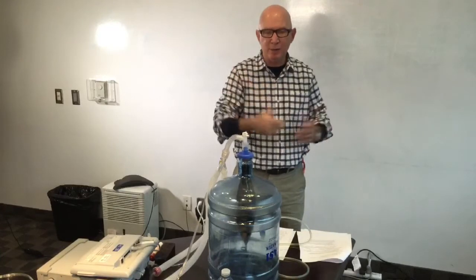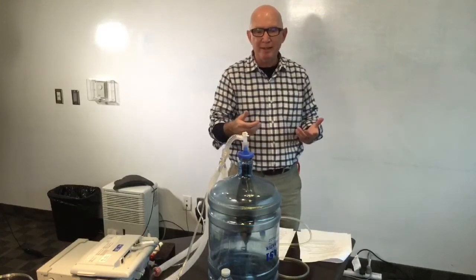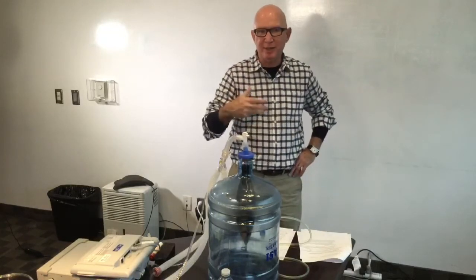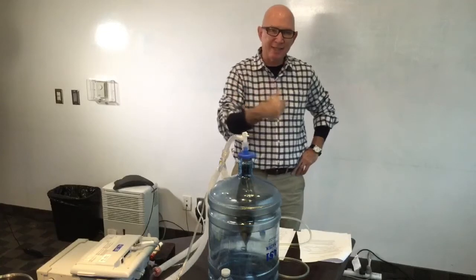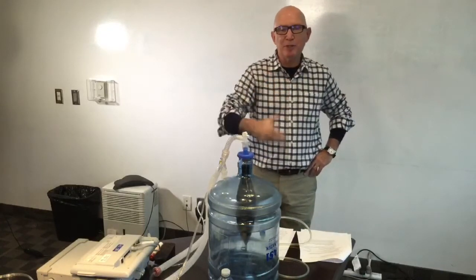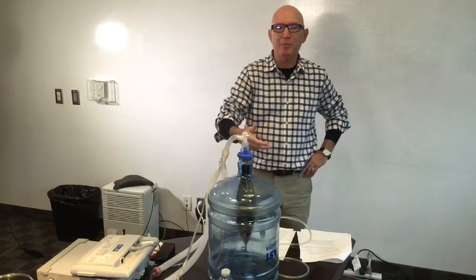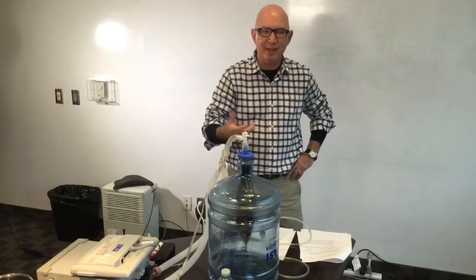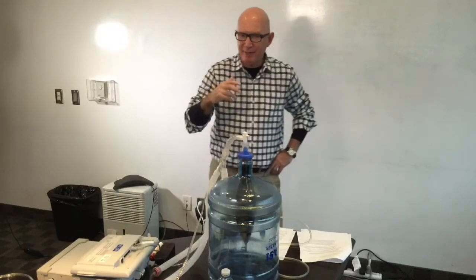Recognizing again, as you well know, that we never use less than 8 centimeters of water pressure support, simply because that's about the resistance of an adult endotracheal tube. So if you decrease the pressure support to less than 8 when someone's breathing spontaneously through an endotracheal tube, then you're forcing more work upon them to take their tidal volume than it would be if you actually pulled the tube right out altogether. Okay. So I hope that answers the question on the SIMV piece.